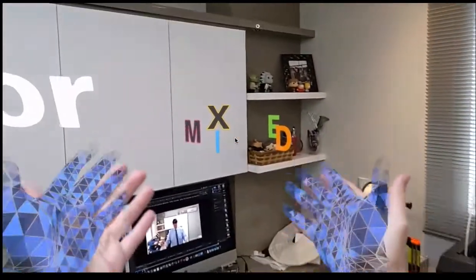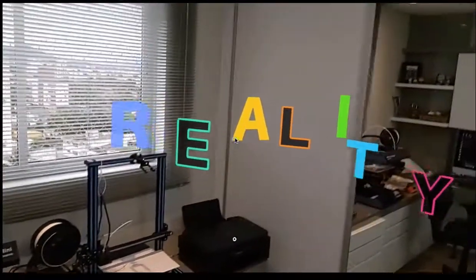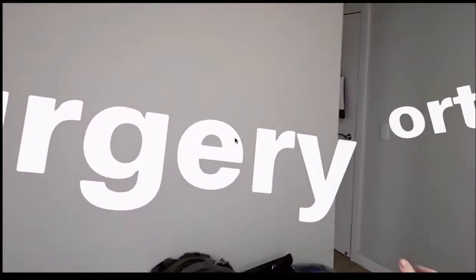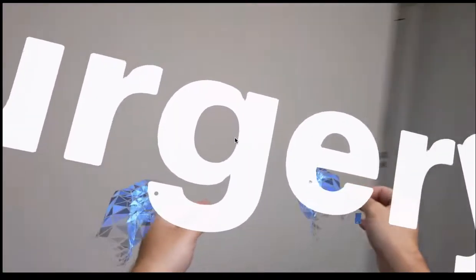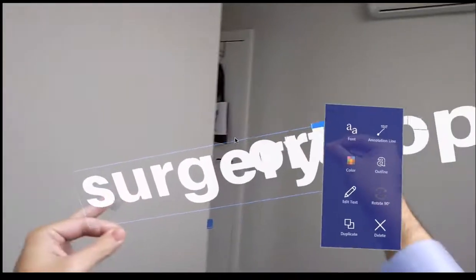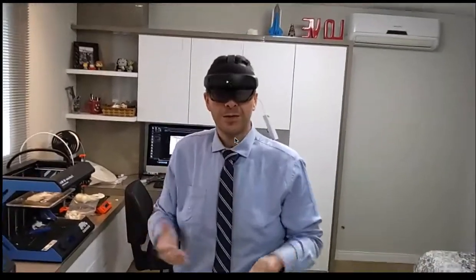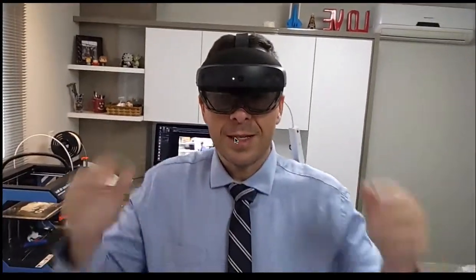Mixed reality for orthopedic surgery. We're going to use this device called HoloLens, with which we can manipulate things such as this text, and we are going to show you how we can use this kind of technology for our cases in orthopedic surgery. Join us. Bye bye.